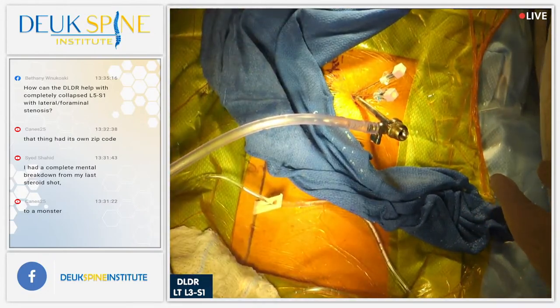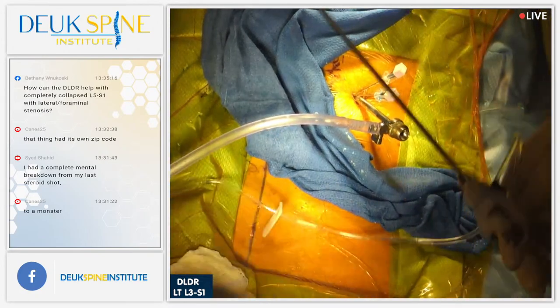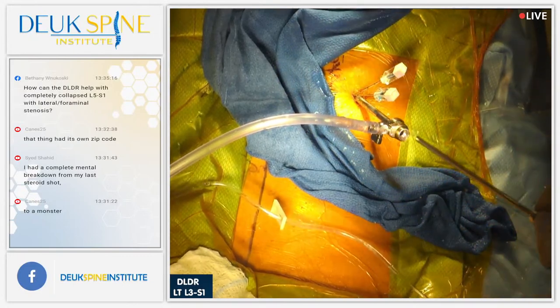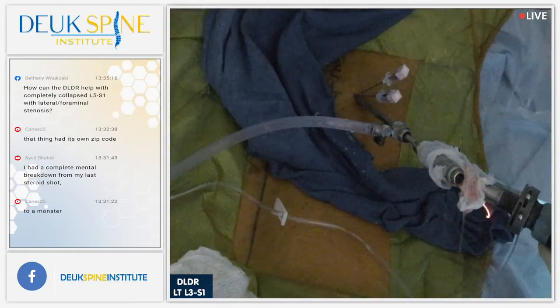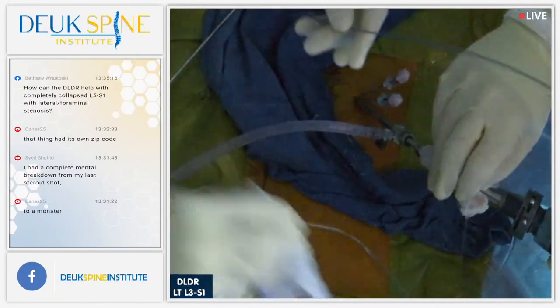How are we doing, Doc? Start. Excellent. All right, keep the questions coming. Great questions. We're going back in. We're going to just do a little more lasering and open up the foramen a little bit more.